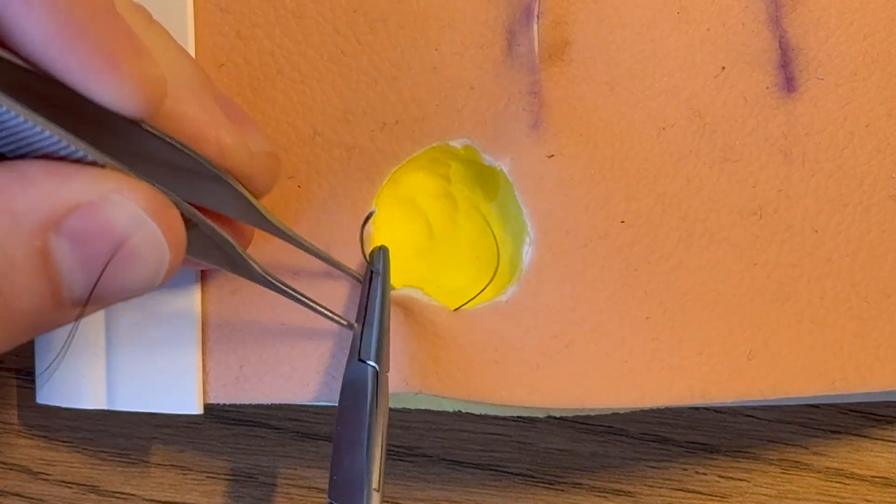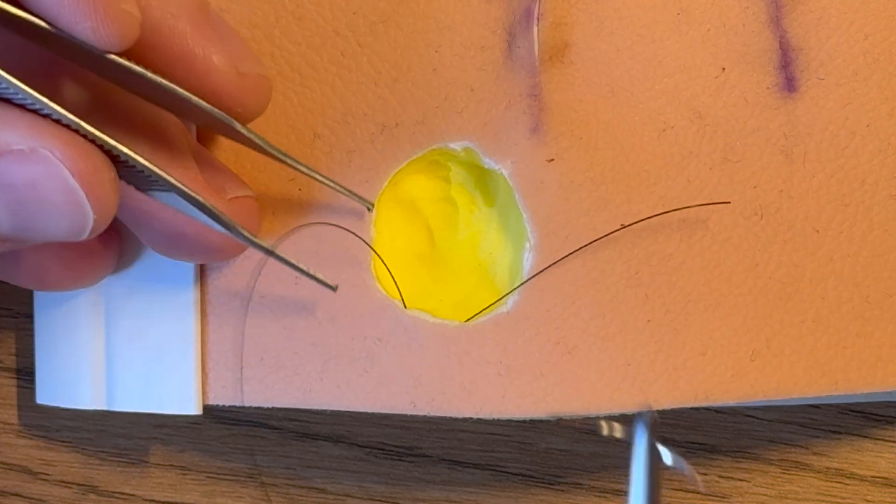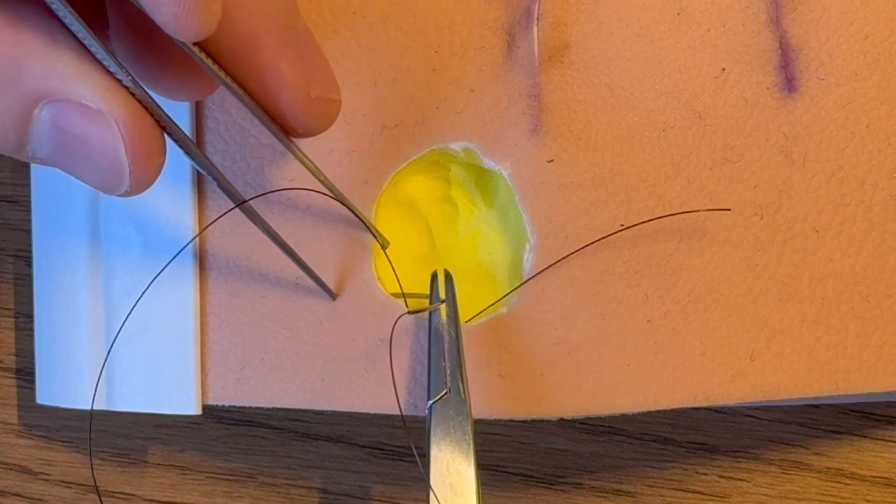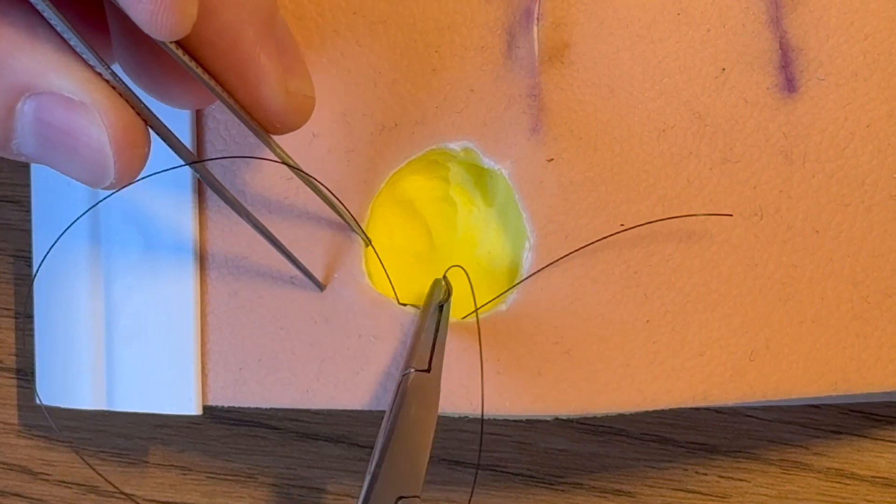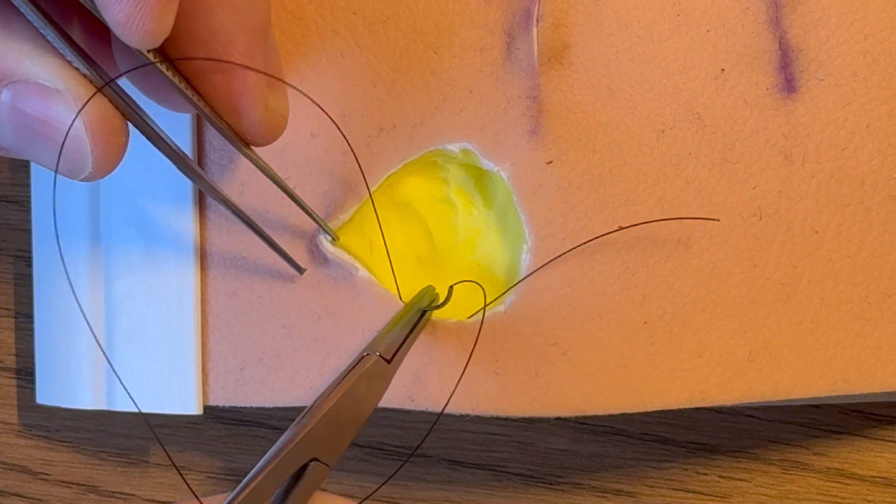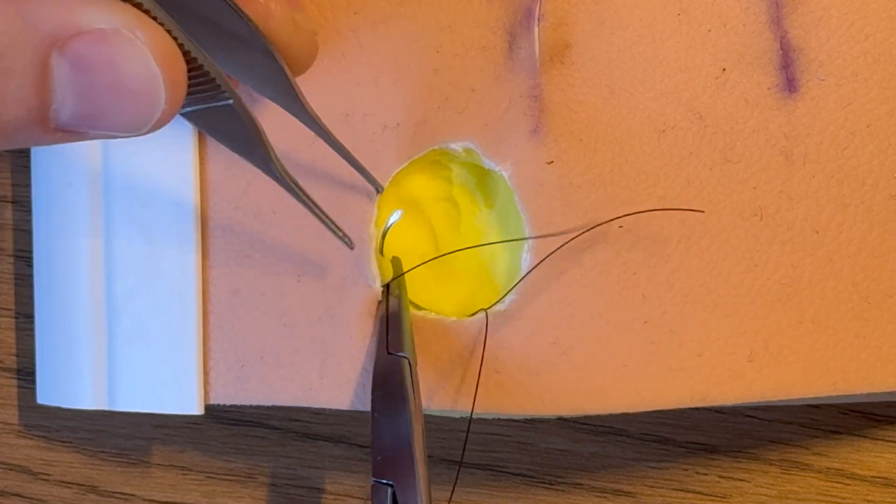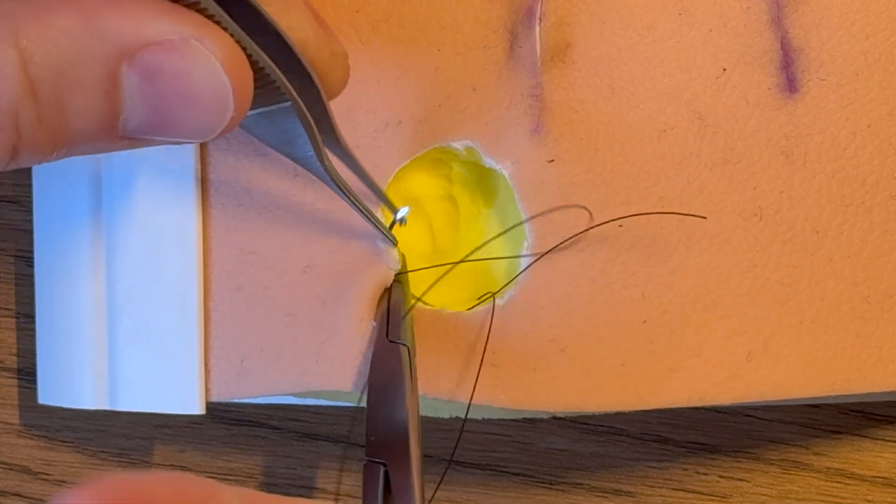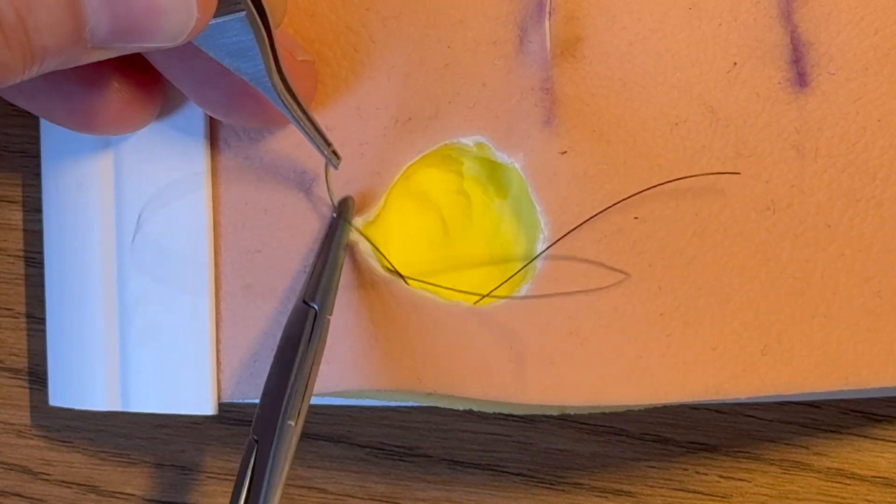Don't grab the sharp tip, and then leave a little bit of a gap. It doesn't need to be right up against it. In and out similar distances. Just grab it again, that could do with a little bit more grabbing. Come out in the fat each time.